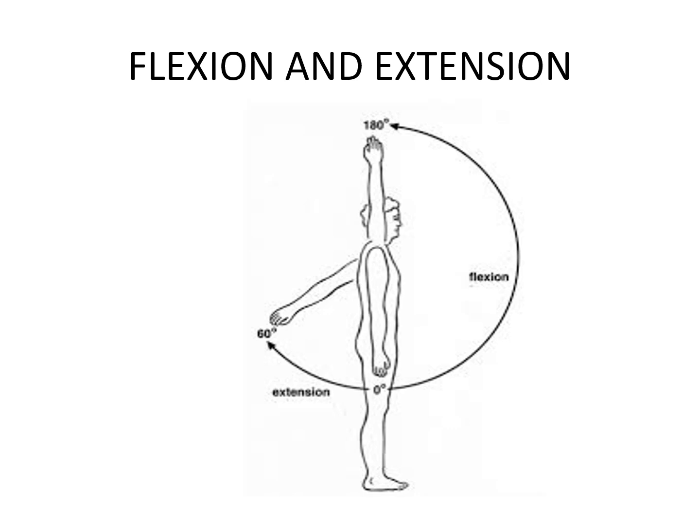Extension is not coming back from top to 0 degrees. That is range of motion for flexion. Starting from 0 and going backwards in the back direction is known as extension, and the range of motion for that is 0 to 60 degrees. Okay, so don't get confused between flexion and extension. When you take it up and above the head level, that is flexion, and when you start from the sideways and take it behind, that is extension.